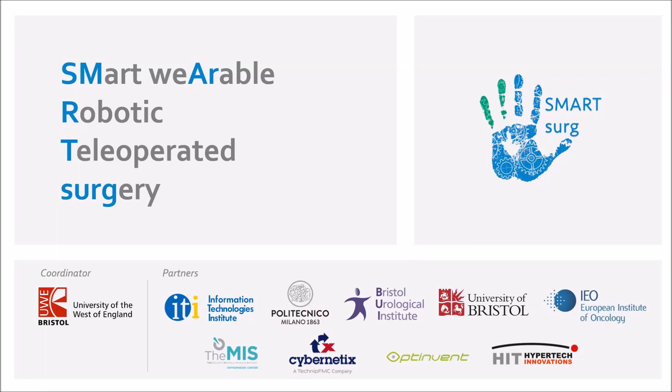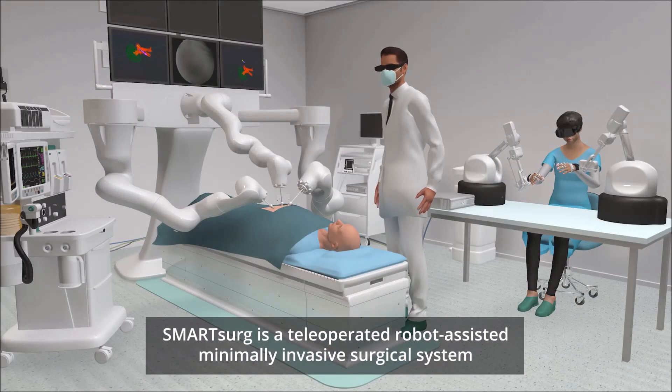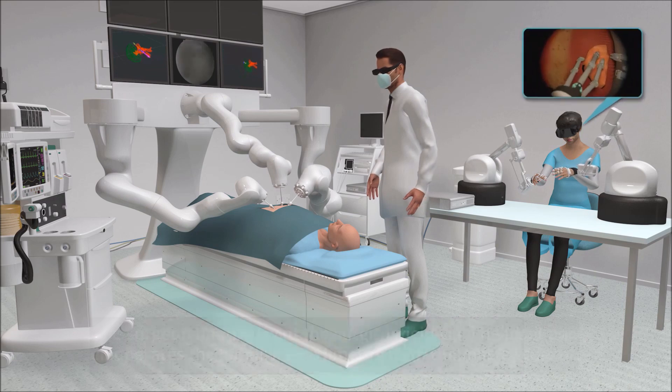The Smart Surge project is implemented by 10 organizations across 5 countries in Europe. Smart Surge is a tele-operated, robot-assisted, minimally invasive surgical system.